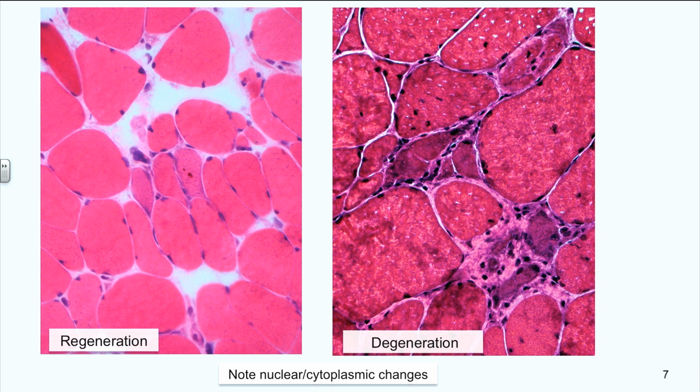Their nucleus is larger because of the lot of ribosomes and protein in the cytoplasm. Their cytoplasm is much more basophilic looking, at least with the staining, rather than being eosinophilic like a mature myofiber. And here is the state that we see, for instance, in fibers such as this one, or this one, or this one.